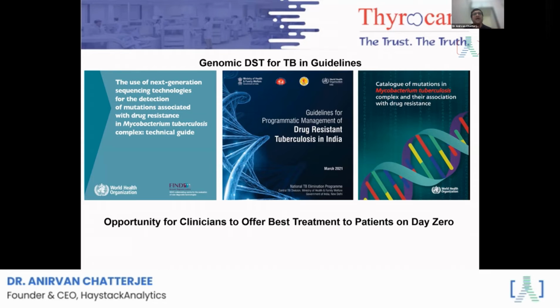Just a few days back, the WHO brought out the updated catalog for tuberculosis. Right now, we are already looking at 18 drugs that the WHO has put out, which can be used for identified drug-resistant tuberculosis using next-generation sequencing. Some of the team members at Haystack are already authors in that report, and we continue to work very, very closely with the government to ensure that all the data that we generate not only helps the patient that is coming today, but helps the patient all over the world with anything that we learn from genome sequencing for every patient that we are able to provide it for.